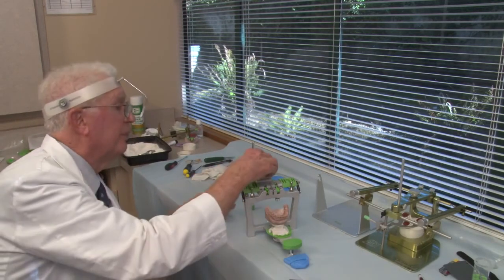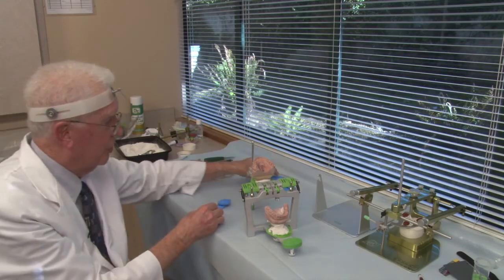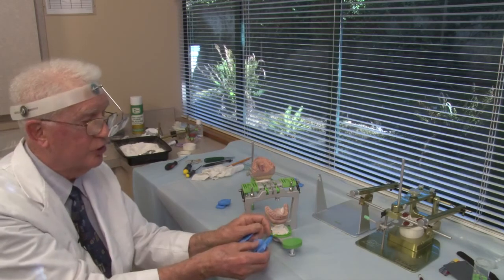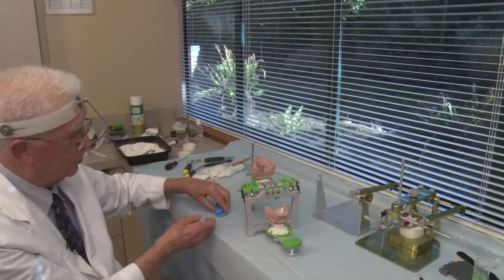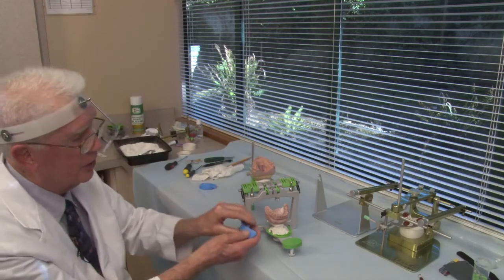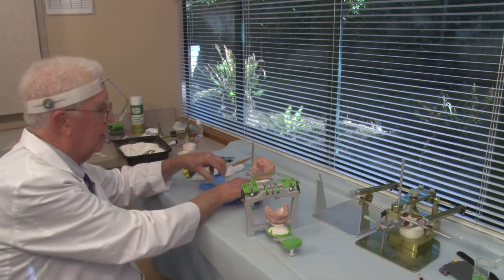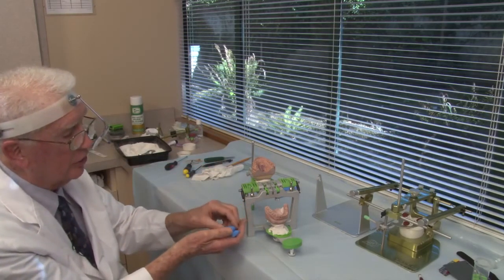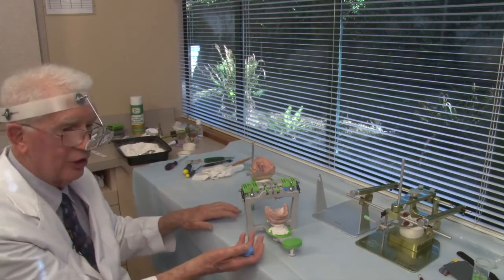Now, let's assume for a moment that I actually mounted these models with these wax bites. Then when I started to use all these other wax bites, none of them would split cast check. So it's a little strange that I use one set of wax bites and then all my other wax bites will not split cast check with this one. So what I would have to do is take the lower model off, come to another set of wax bites, and remount the lower model using a new set of wax bites. And then I would verify the accuracy of the mounting by split cast checking with all the other wax bites. So that's one reason I took 2 power-centric bites, just in case I didn't get split cast checking with one and I did with the other. So these will be thrown away. They're no good. Now I know how to mount all my other lower models.